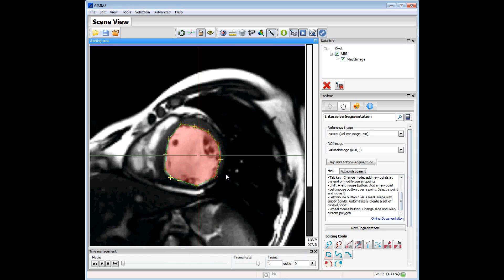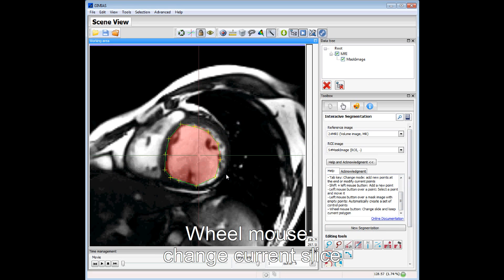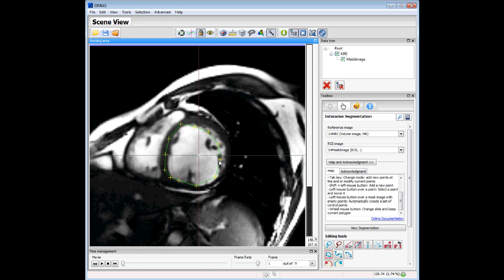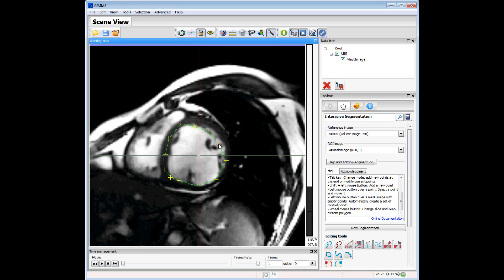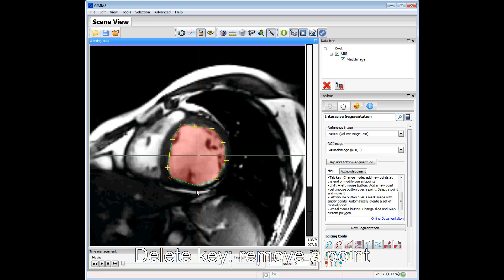We can also use the mouse wheel to change to another slice, and the control points are kept in the same position. We can modify the control points to adjust to the region we want to segment and press the Space key to paint the inner zone. If there is a point we don't need, we can press the Delete key to remove it, then press Space again to paint.